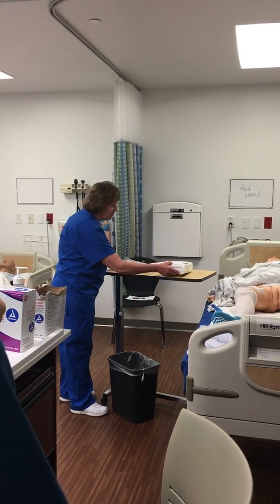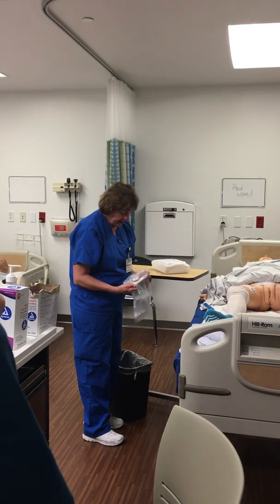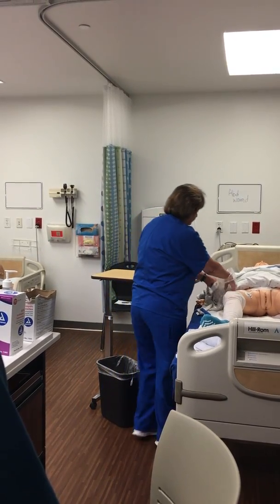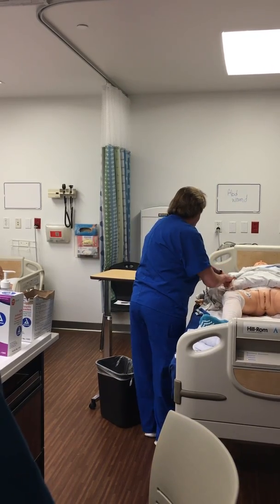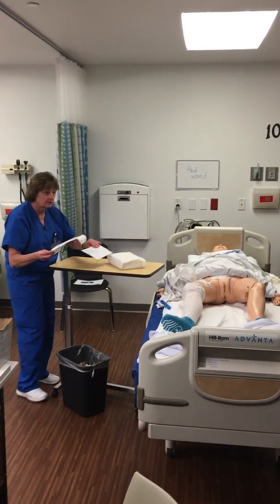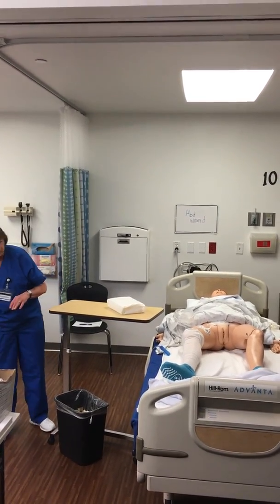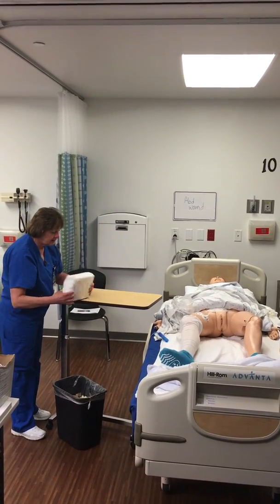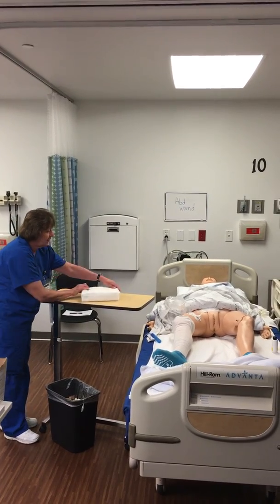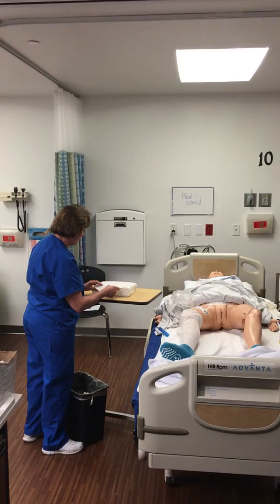I'm going to take my kit and then use this as an extra trash receptacle. Now you guys keep all parts of your catheter kit, okay? Save this for yourself too. Now I have to get into my kit — these are sealed. Does the kit include gloves? Yes, the kit includes gloves.